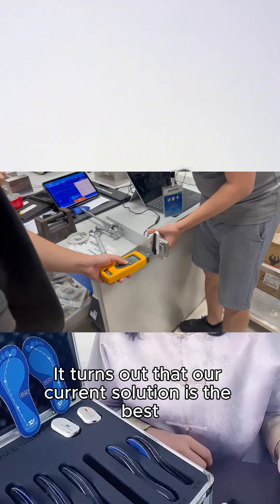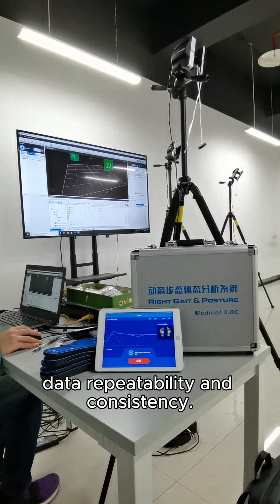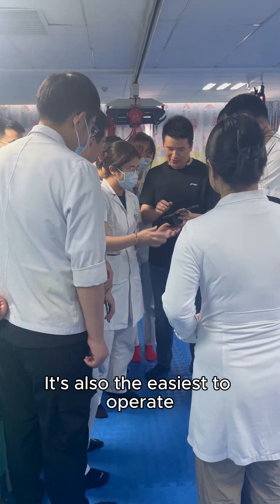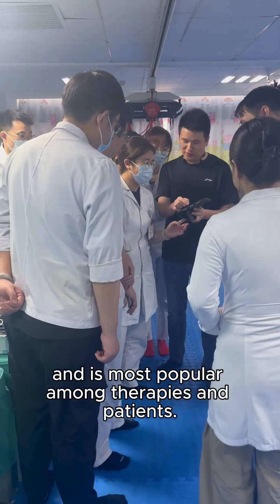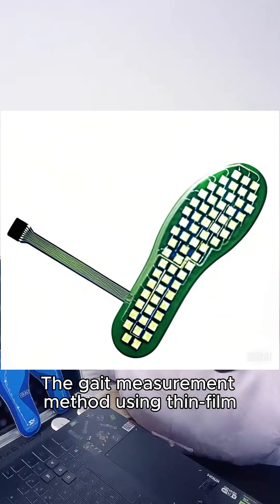It turns out that our current solution is the best in terms of data collection volume, data repeatability, and consistency. It's also the easiest to upgrade and is most popular among therapists and patients.